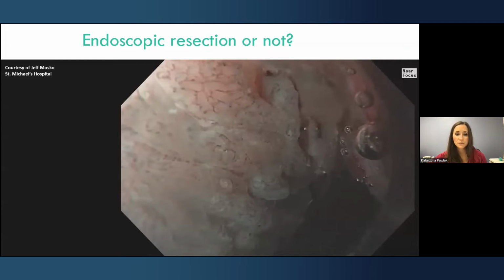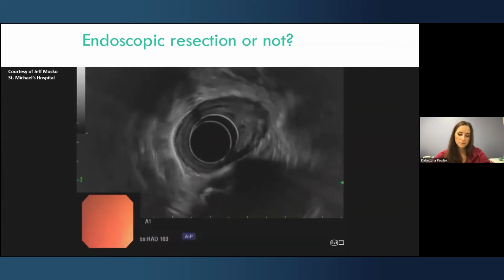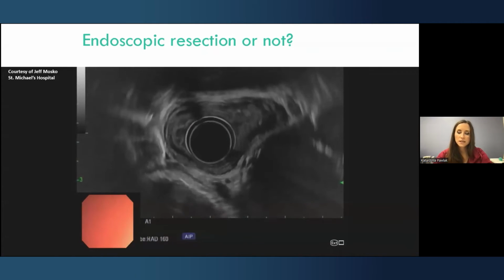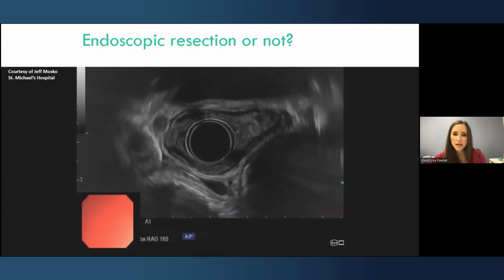esophageal lumen. And then we provided an EUS assessment for this lesion. It's a little bit different than the previous one because we have something extra, and you can see on the screen actually. The lesion is visible here, and you can see also how it looks when we take a look at particular layers, especially the muscularis propria layer.